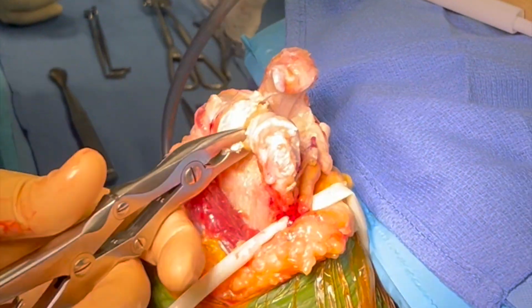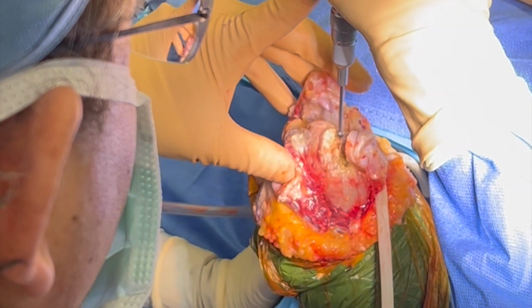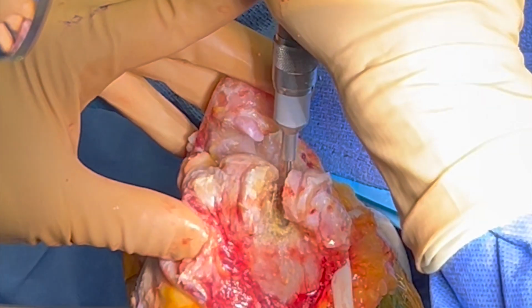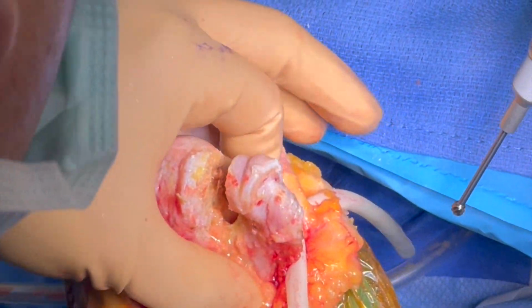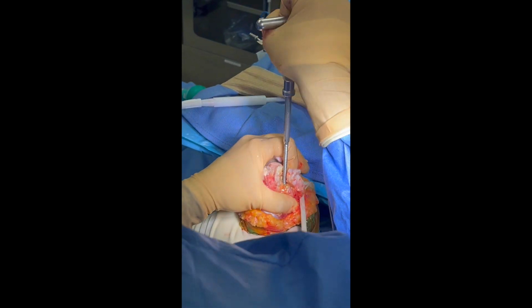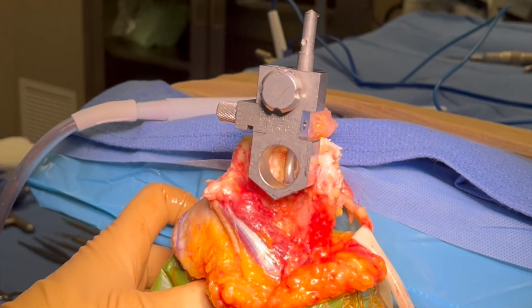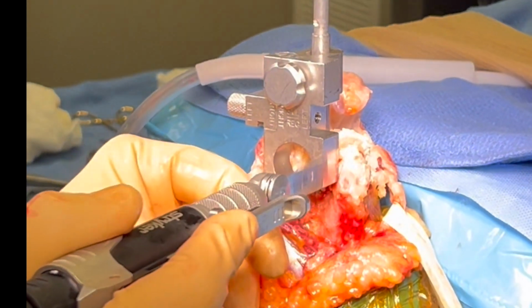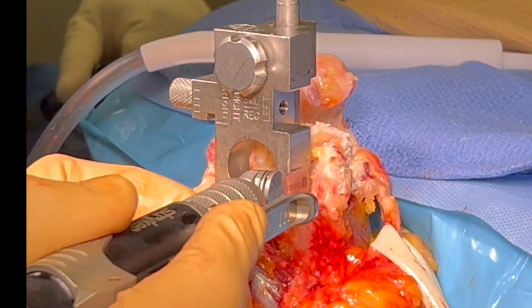The central portion of the trochlea is next resected with a rongeur, and then the high-speed burr is used to find the opening to the medullary canal of the humerus. The canal finder is next placed into the humerus, and then the cutting guide is attached to the medullary finder, and the appropriate saw cuts are performed on the distal humerus.